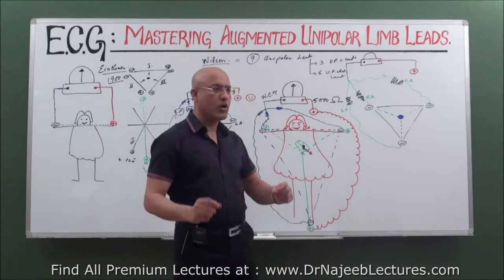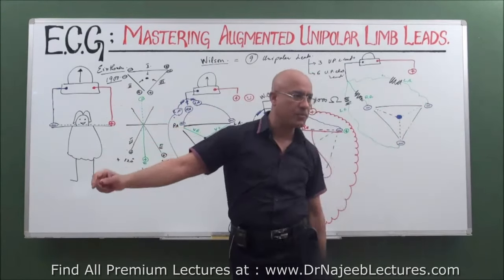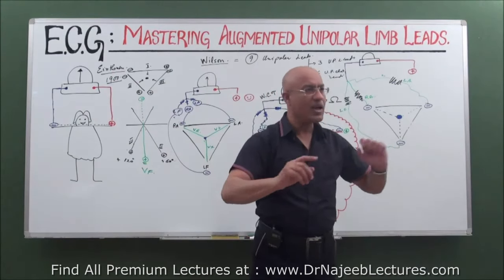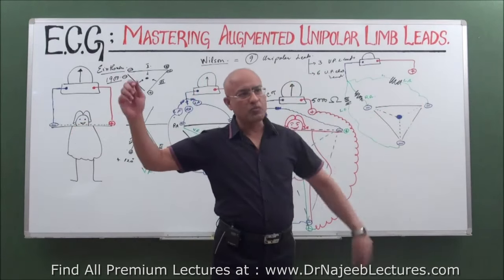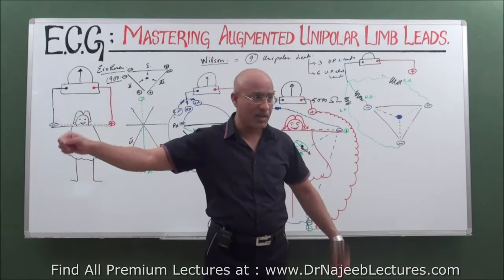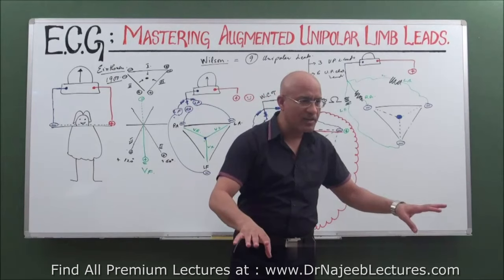Now I will ask you a question. If you want to make more leads like Wilson, first of all, the negative terminal will be connected to right arm, left arm and foot. You achieved an indifferent electrode in the center of the heart, right? Done. After that, the positive electrode you put on the foot, you have made VF. Positive electrode on the left arm, VL. Positive on the right arm, VR. Voltage from the right arm, VR. Voltage from the left arm, VL. Voltage from the foot, VF. Simple as that. Left foot, of course.